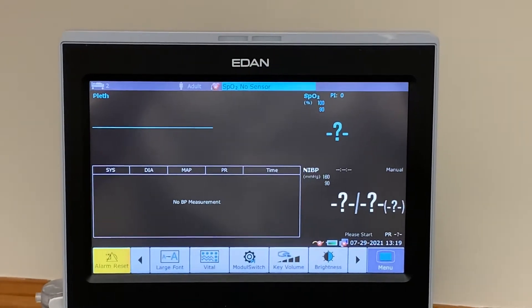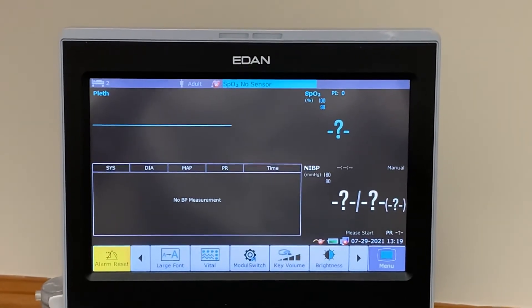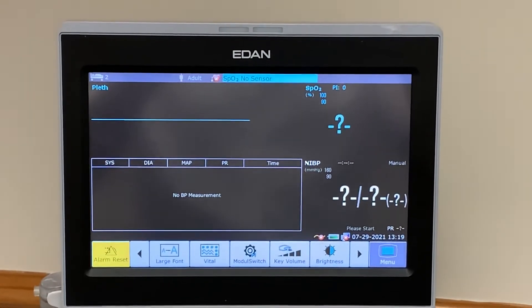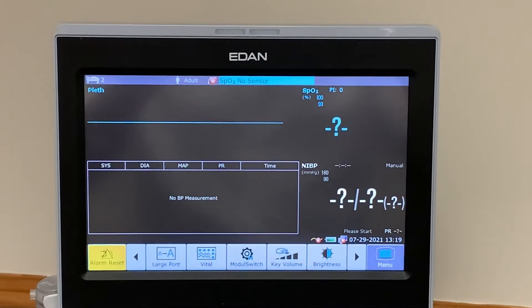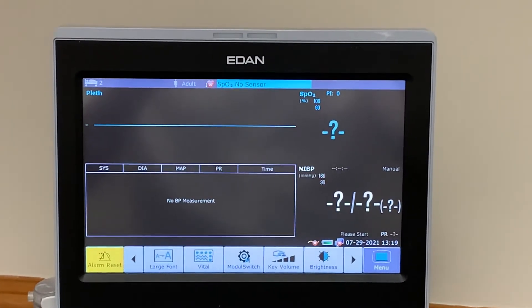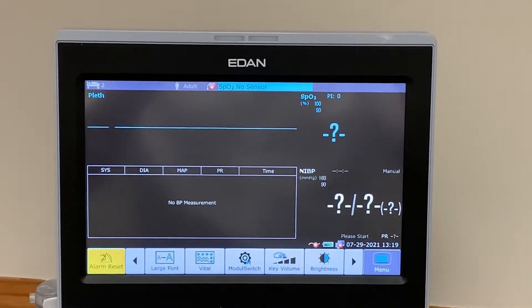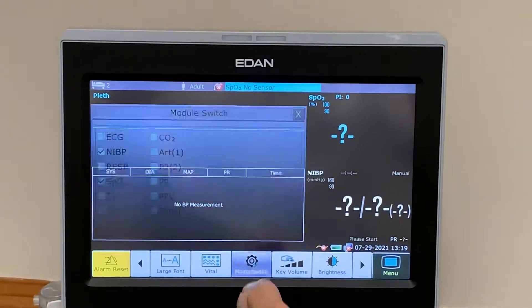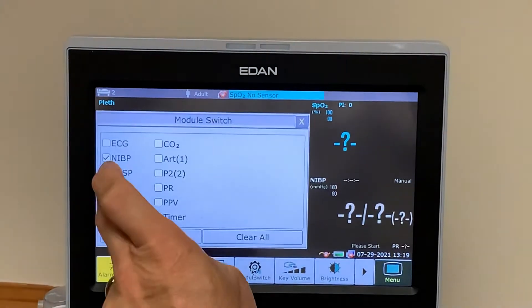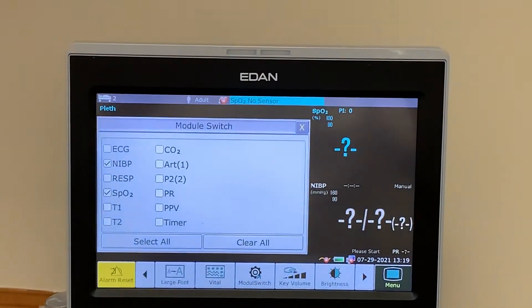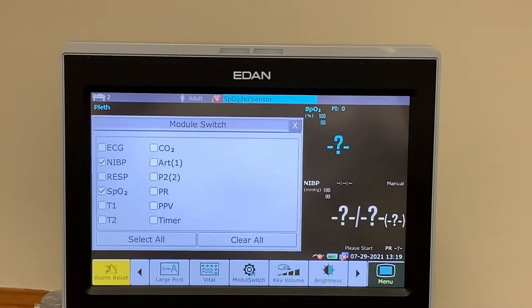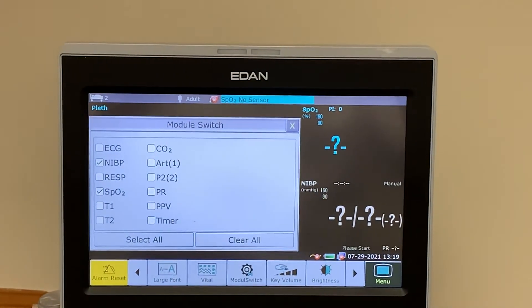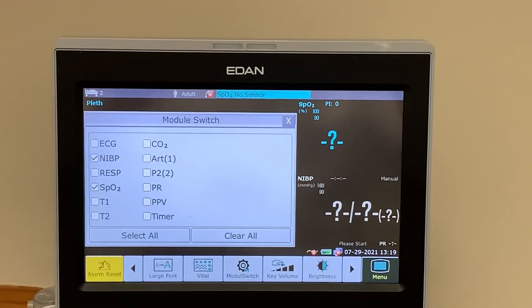Before I get to the more permanent method — if you wanted to bring parameters back, simply press Module Switch and tick the various boxes that you need to put back onto the screen.